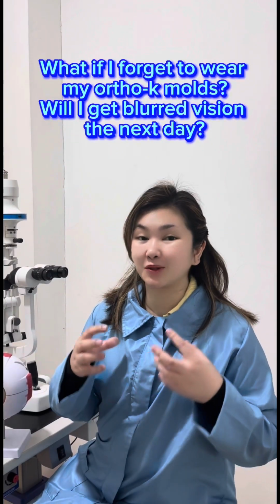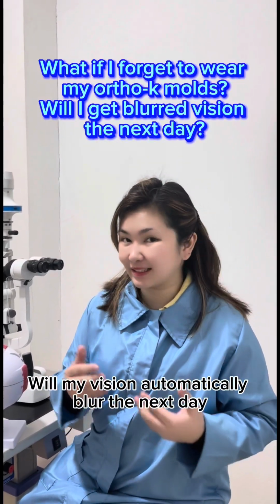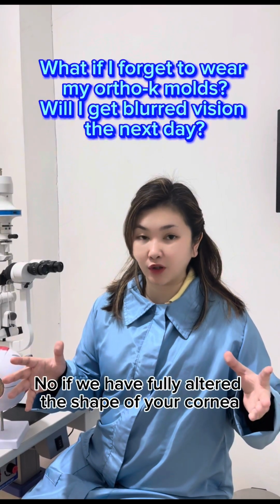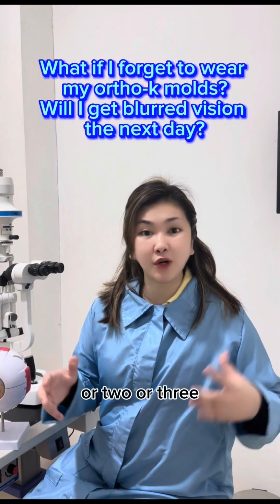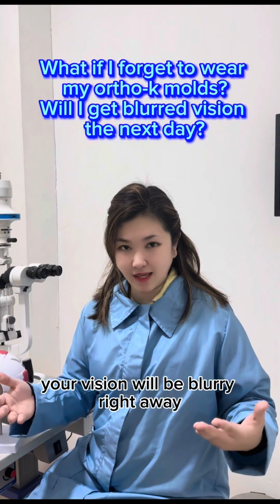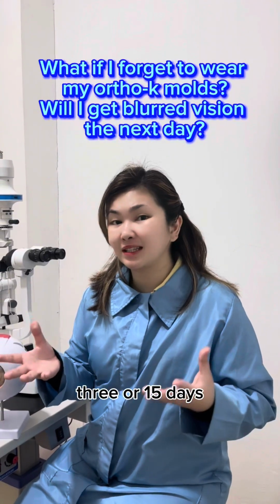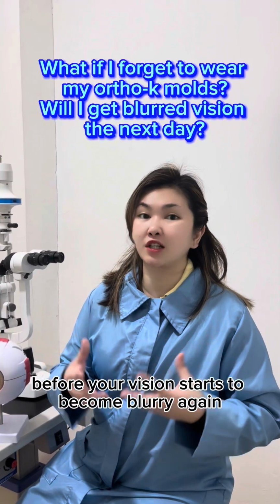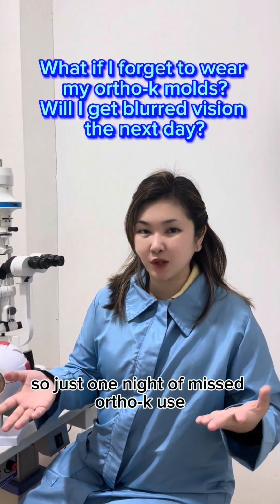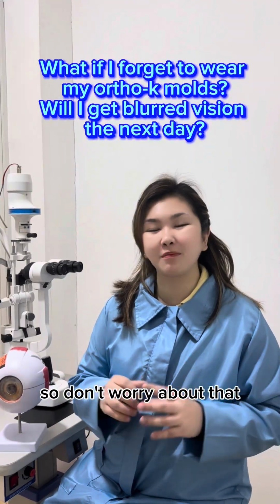What if I forget to wear my Ortho-K molds? Will my vision automatically blur the next day? No. If we've fully altered the shape of your cornea and you miss one night, 2 or 3, it won't mean that your vision will be blurry right away. It will take approximately 2, 3, or 15 days before your vision starts to become blurry again. So just one night of missed Ortho-K use won't cause you to have blurring of vision the next day. So don't worry about that.